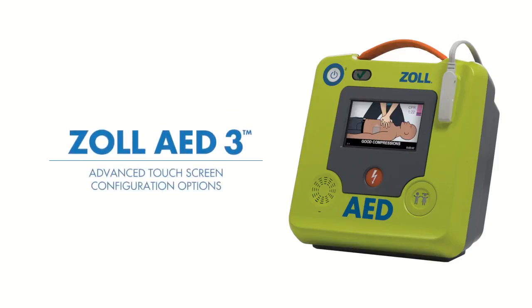The ZOLL AED3 includes advanced configuration options that enable you to quickly and easily configure your AED. This can be done directly on the device using the AED3's full-color interactive touchscreen display. In this module, we will familiarize you with the advanced configuration options available on the ZOLL AED3.